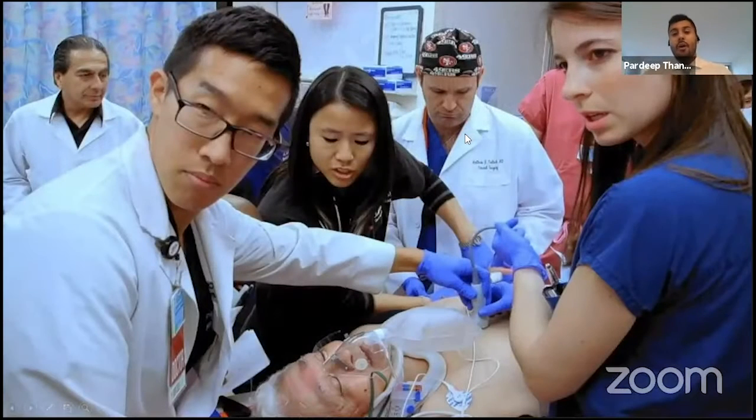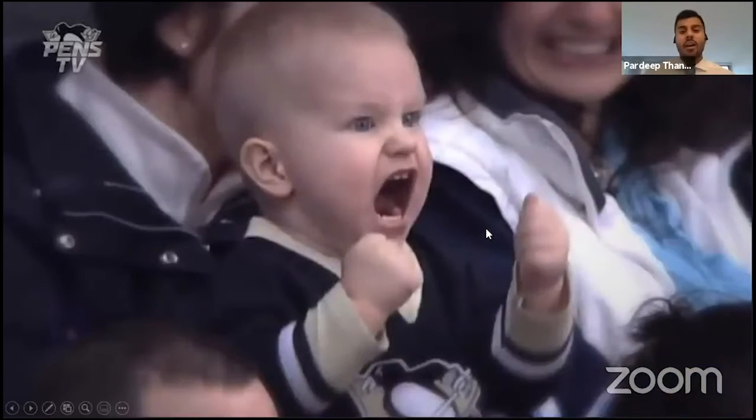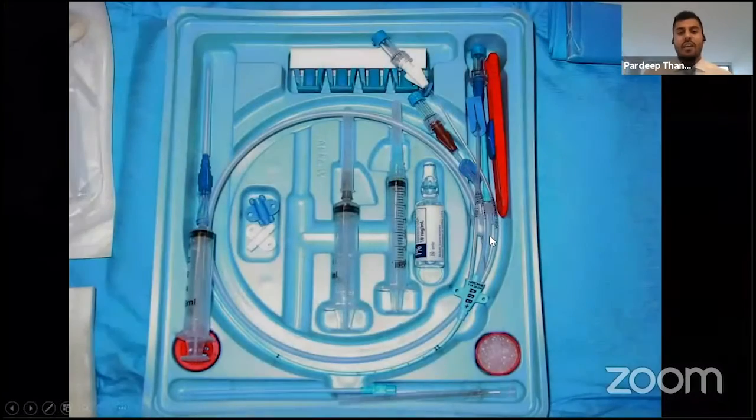So say after your conference today, you have to work, but you come in and the first thing you see is a sick patient. You look at the IVC, it's collapsed. And you look at the monitor and the MAP is less than 65. So of course, the first thing you are is excited. Why? Because you are going to do a central line.